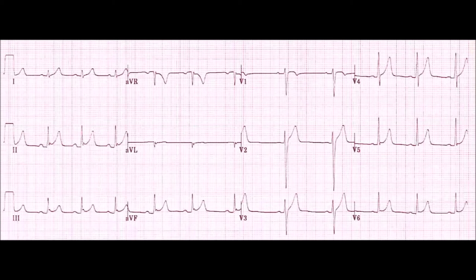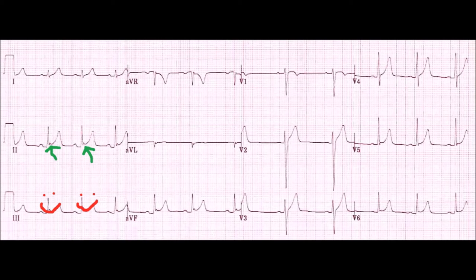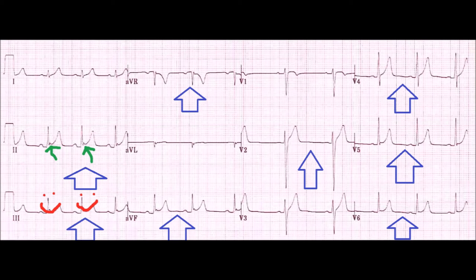Let's take a look at a BER ECG. You'll notice some diffuse ST elevation, and you might wonder if this could be pericarditis. Well, let's look at why it's not. The very first thing we notice are the smiley face signs. Then we notice the notching at the J point, which is characteristic of BER. Moving forward, we can see ST elevation everywhere. You'll also notice an absence of the knuckle sign, which is something I'll cover in a future video on pericarditis.